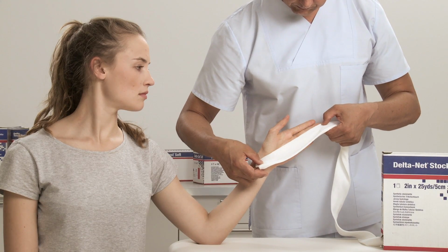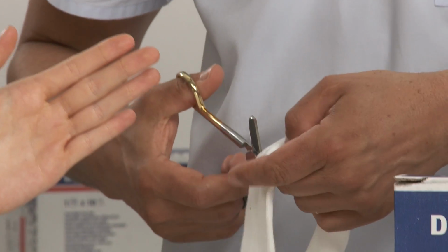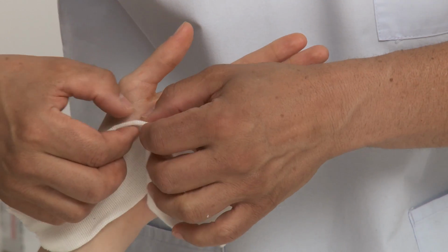Choose appropriate width of stockinette that will fit snugly but does not constrict the patient's hand. Measure the length from wrist to fingers and cut it. Measure where to place the thumb hole and make a little cut with scissors.